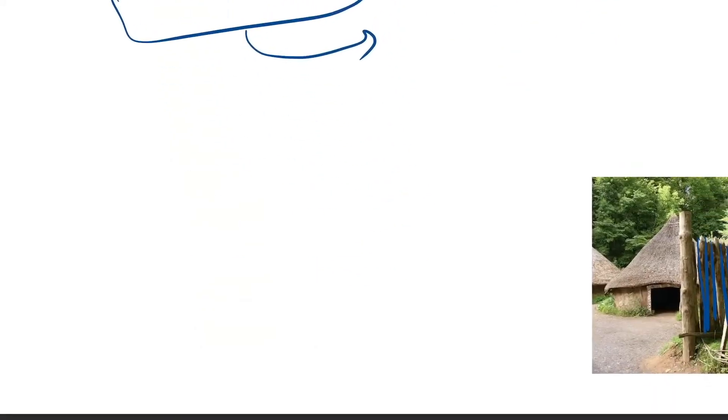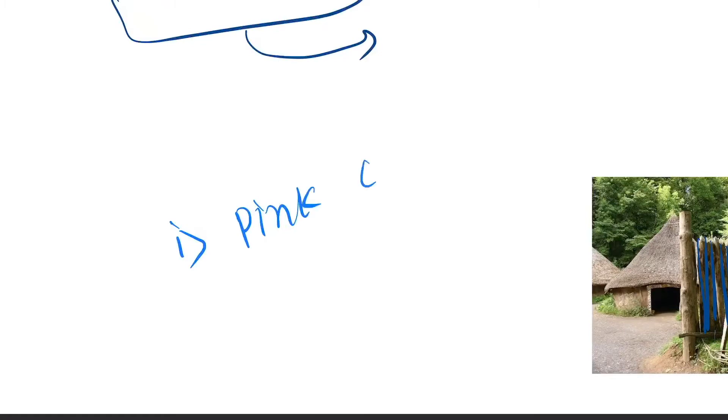And the next feature will be the pink reticular fibers.